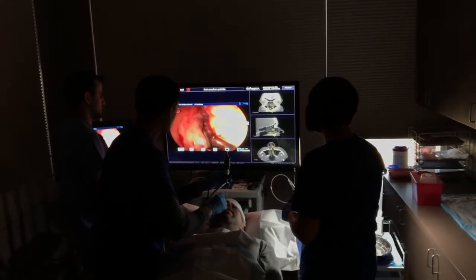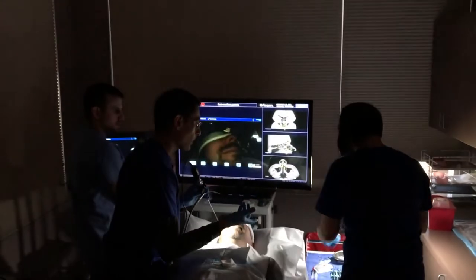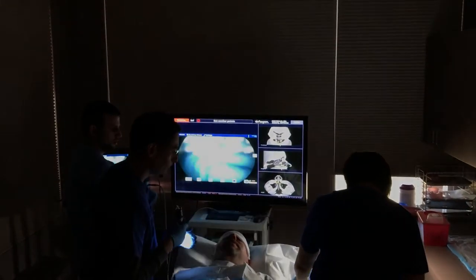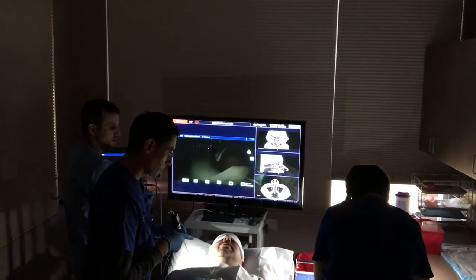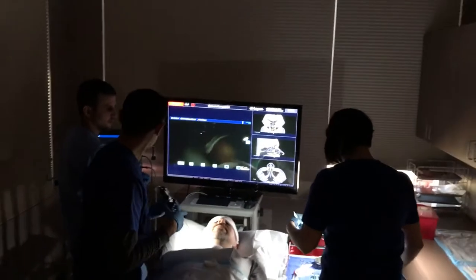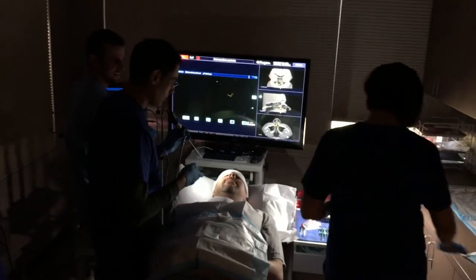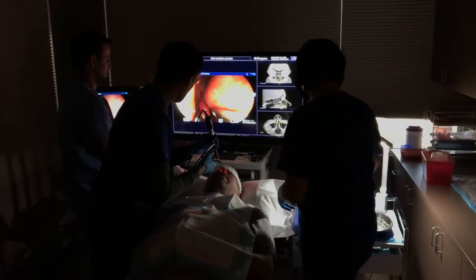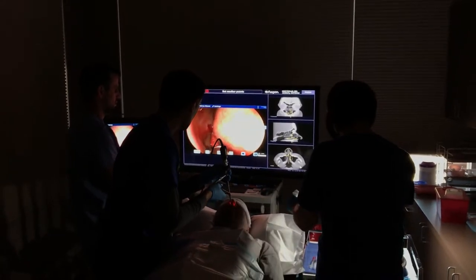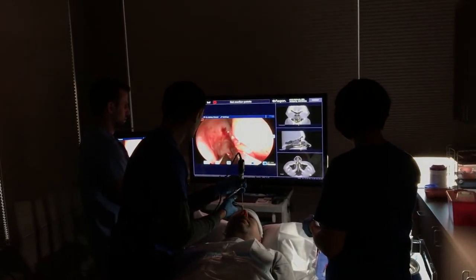There's an area of blockage here. We're just opening that up now. Just kind of take away that blockage here in a non-invasive way — just thin that down and it just kind of opens that area up there.